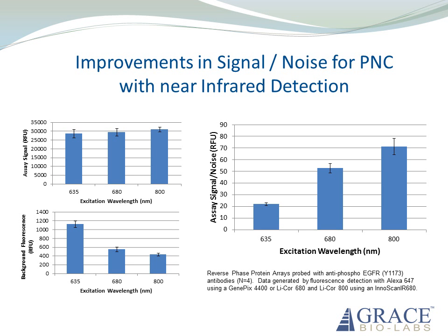We were particularly interested in knowing how much of the signal to background would be improved as we varied the label wavelength. We prepared similar assays using 635, 680, and 800 nanometer organic dyes and set up the scanning parameters so that we obtained nearly equal signal strength in each case.